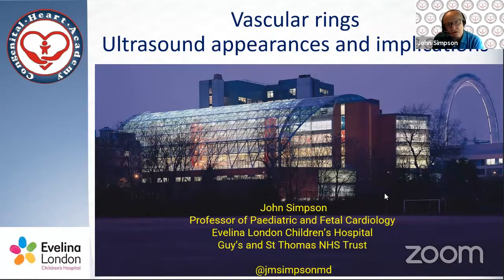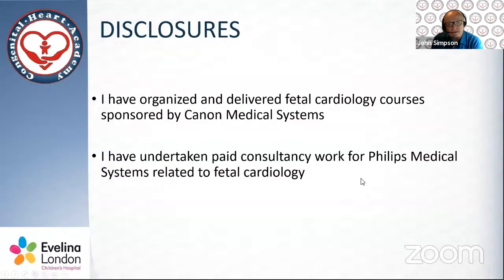So I'm going to take about 20 minutes or so to talk to you about vascular rings and the ultrasound appearances and implications. I'm going to try and focus down a bit because I think if we try and cover everything, it's going to get too much. So I'm going to try and cover some of the main things.